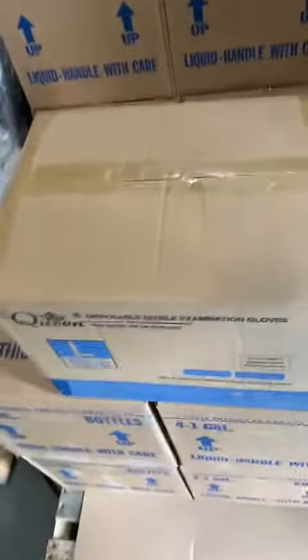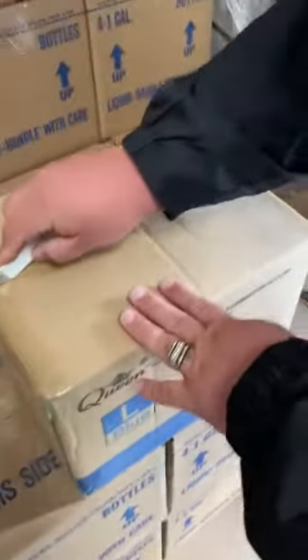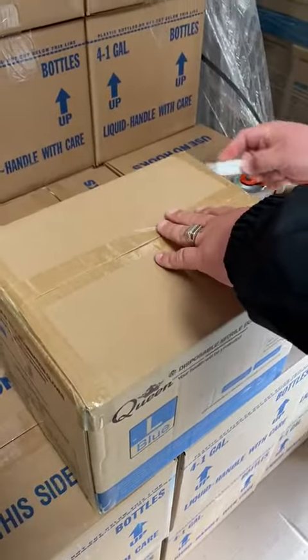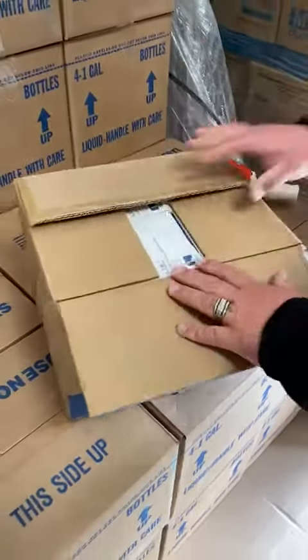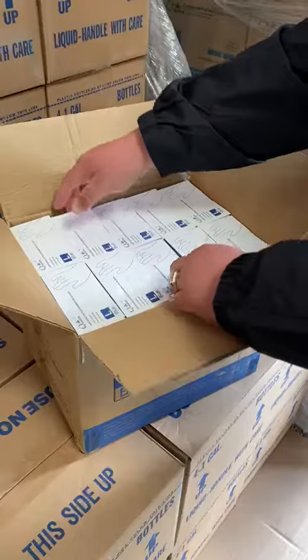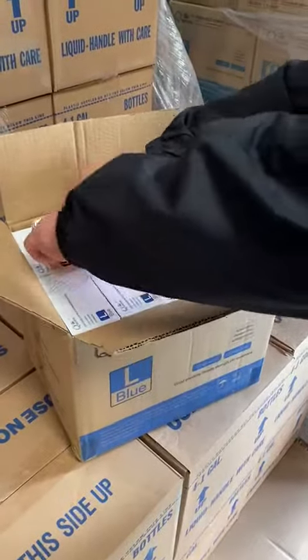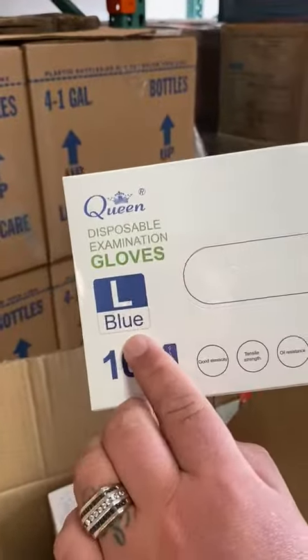So you can see — open, brand new box. Queen disposable examination gloves, large, blue in color. That's the new shiny box.